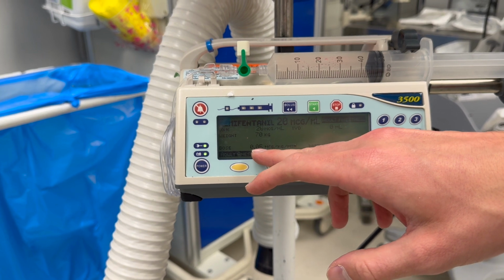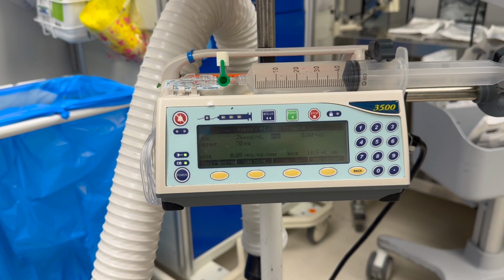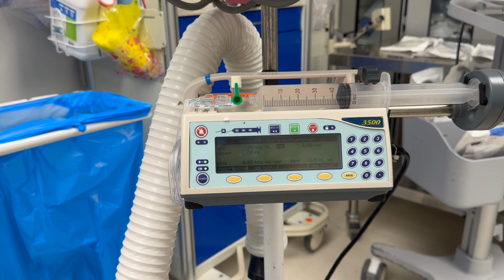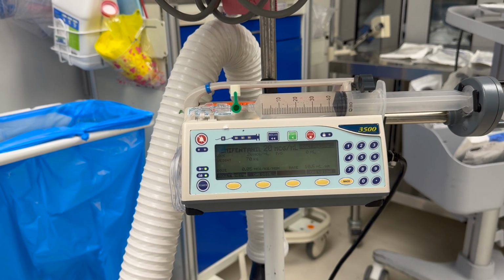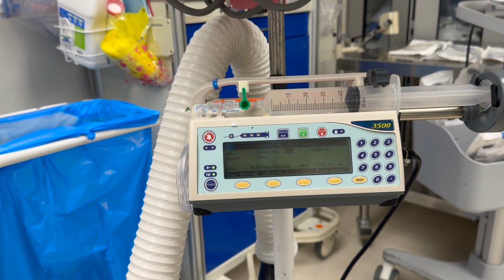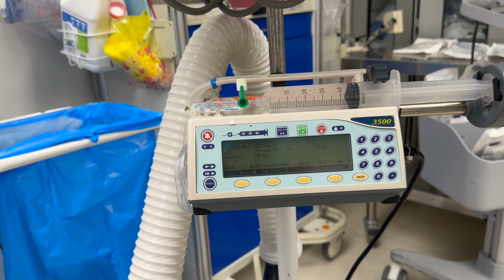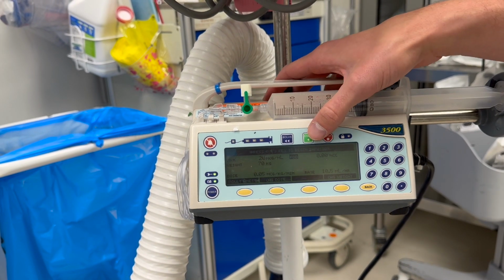It is set to a baseline dose of 0.05 mics per kilogram per minute. That is an okay dose to start with. As I said, this is a very potent medication that can very much drop your blood pressure if given too quickly, so this is a decent dose to start with, although I would say most patients typically run at 0.1 mics per kg per minute. But once we have this in, we have our correct weight, we have our correct dose, we will simply press start.